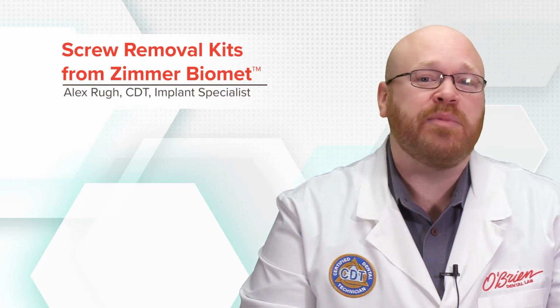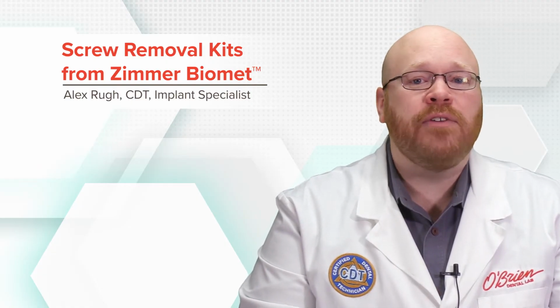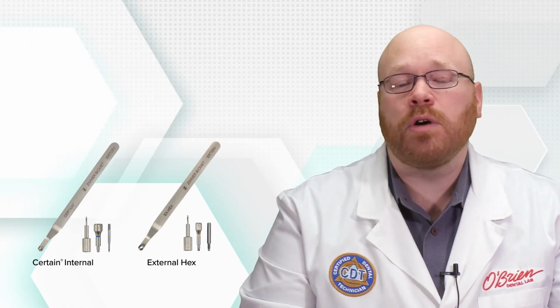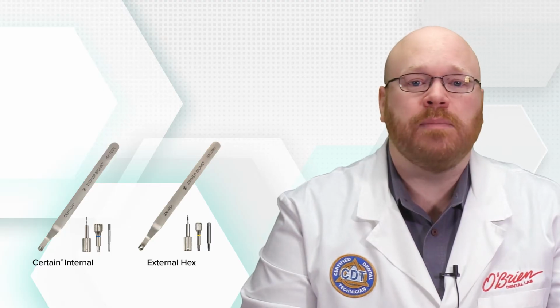In this video, I want to show you the screw removal kits from Zimmer Biomet, which could be used to remove a broken screw from an implant. There are two screw removal kits available from Zimmer Biomet. One is designed to work with the certain internal connection implants, and the other is for the external hex implants.